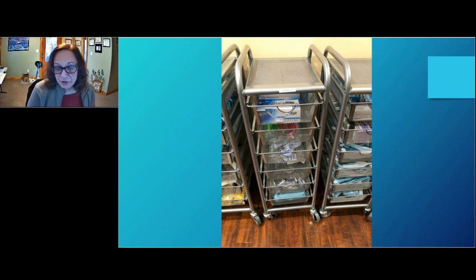Again, with the mesh trays. I just wanted you to get a really good view of this. These are items that were sterilized in-house, as well as sterile items supplied by manufacturers, so they come sterile already. So when you talk about sterile storage, it's not just what you've sterilized, it's all your sterile stuff, whether it's burrs or endodontic equipment or whatever you may have. Everything should be stored in the same manner if it's sterile.